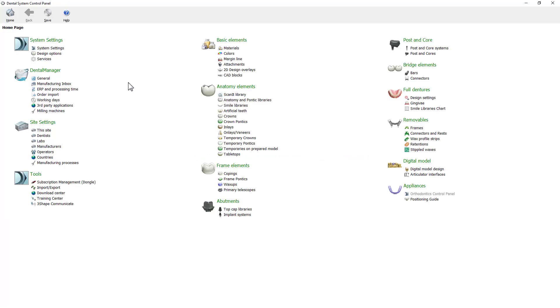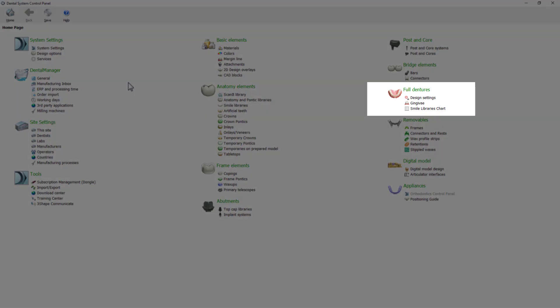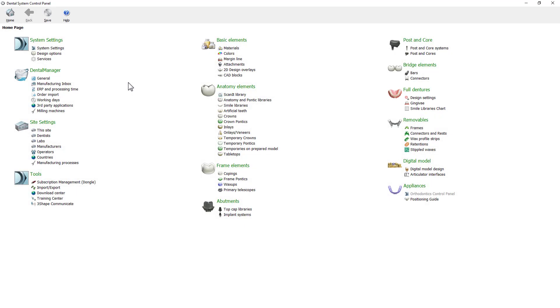In here we have a few options available for full dentures: design settings, gingiva, and the smile libraries chart. Let's start from the design settings.